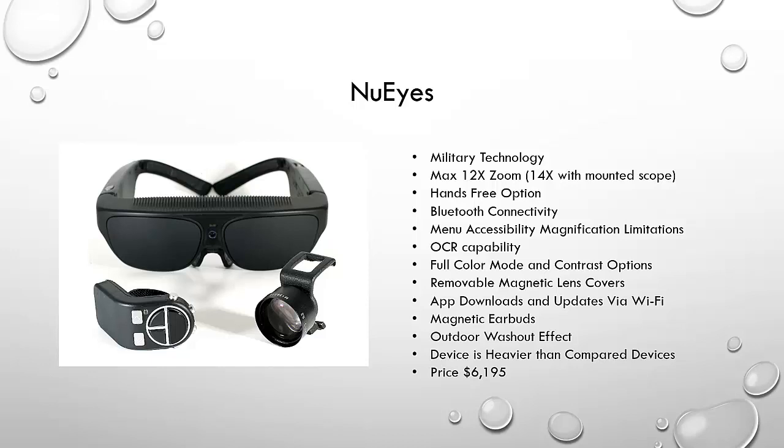The next device is NuEyes, a military technology with a max 12x zoom — which can be increased to 14x using a small telescope that clips onto the middle of the frame. There is a nice hands-free mode with no wires connecting to the glasses, but there is a Bluetooth wireless remote that slips over your index finger and lets you navigate menus with your thumb. You can also access menus from buttons on the glasses themselves. There is a menu magnification limitation — you cannot magnify the menu — but you can connect to a smart TV via Bluetooth or hand the device to someone else to help navigate.